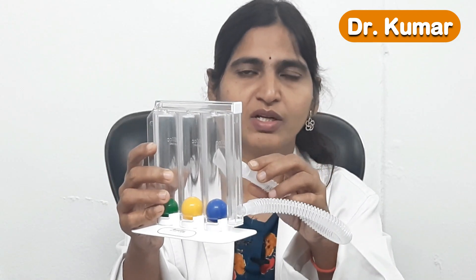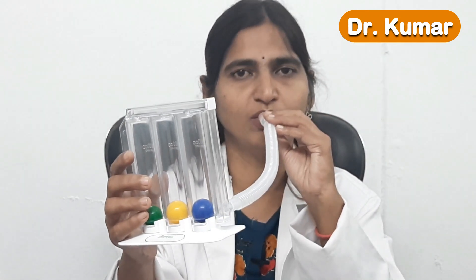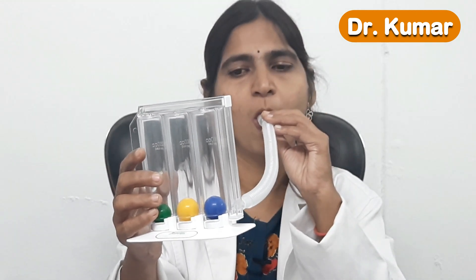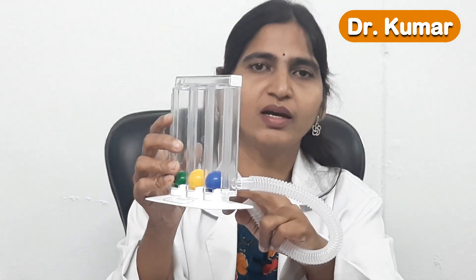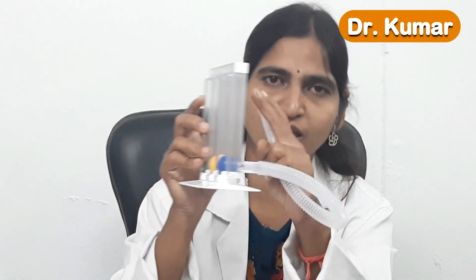Before starting the procedure, exhale the air, then place the mouthpiece in the mouth and inhale so that the balls rise upwards. Try to make sure the balls remain raised for at least four to five seconds — that means inhale the air, hold the breath for four to five seconds, then exhale and the balls will fall down.